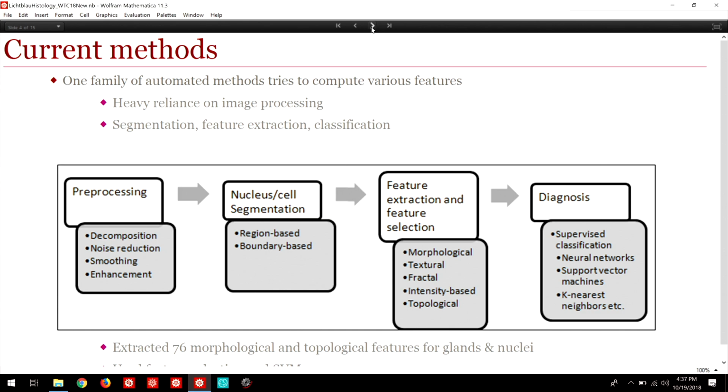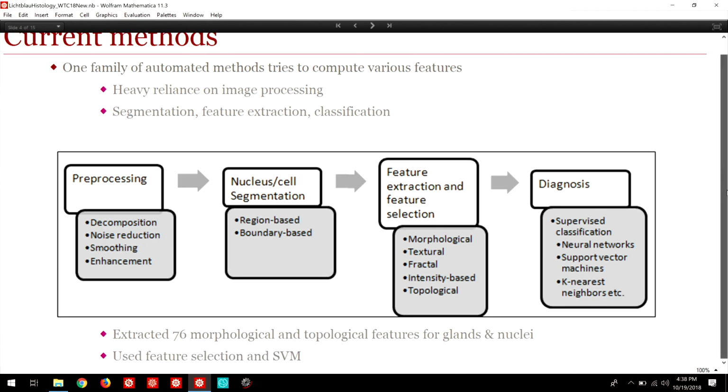So what was my approach? This happened around 5 years ago, so I followed the usual guideline. I had to pre-process the images, to segment, to look for some components in these images, then extract some features, and then after this we end up with too many features, so we have to select out of these features the ones that are important, and finally apply a classifier in order to reach the class of an image.